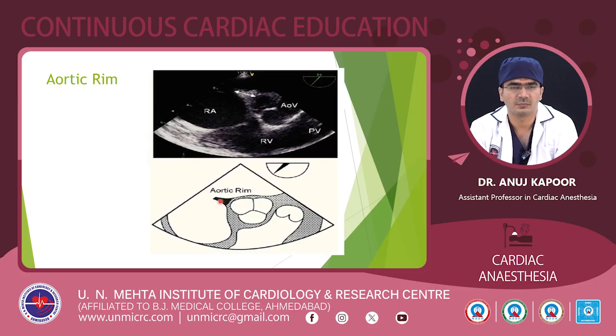So we remain in the mid-esophageal position and rotate the angle to 45 degrees, where we can see the aortic valve here and an aortic rim that is seen protruding. We have to measure it, and we can also see the ASD in this view. And from the aortic valve to the end of the rim, we will have to take the measurement.